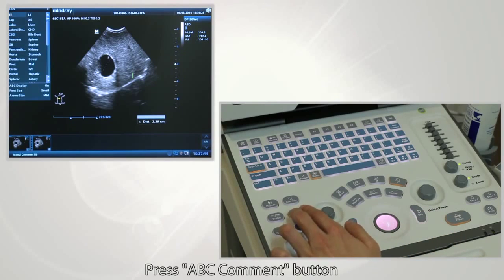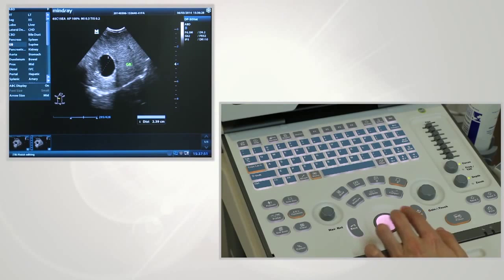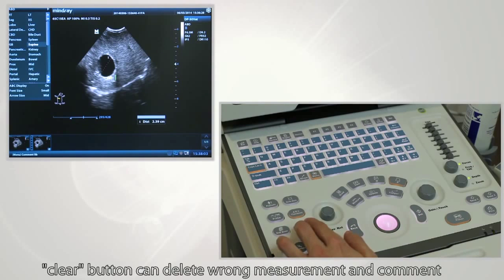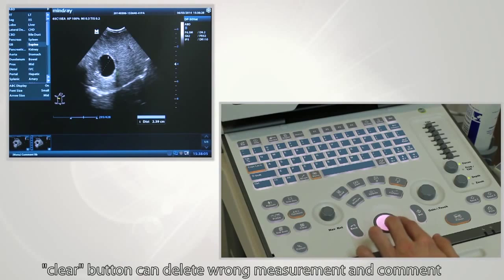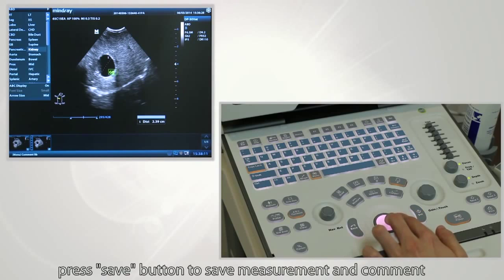You can press the ABC comment button to add comments for review in the future. Press the clear button to delete wrong measurements and comments. Press the save button to save measurements and comments.